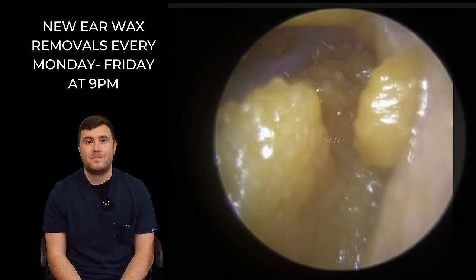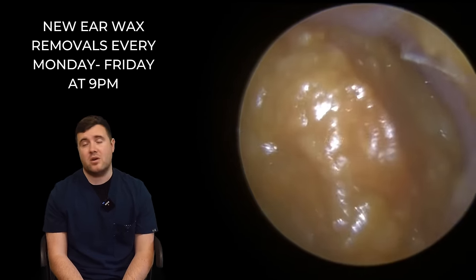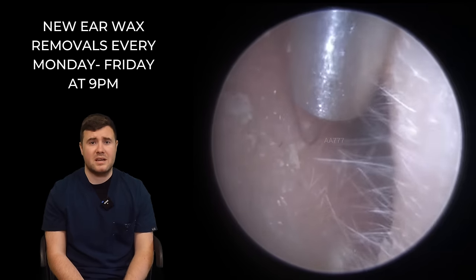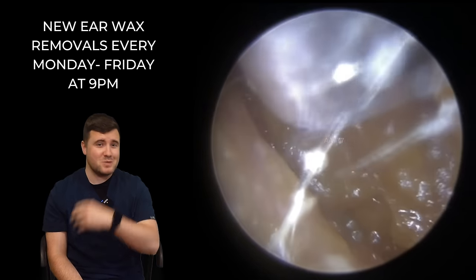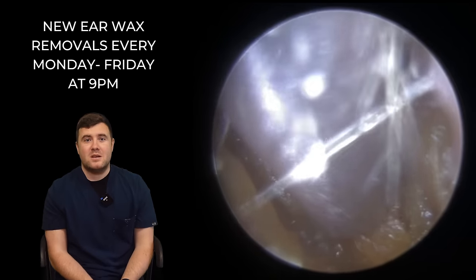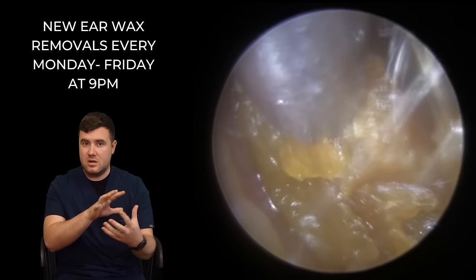So that was before, and this is the after shot. We've got exactly the same story on the other side — a complete blockage on both sides. We're going to start with the standard-sized Zonor tube this side as well. So we're trying on this side, trying to just hold the suction onto this plug.